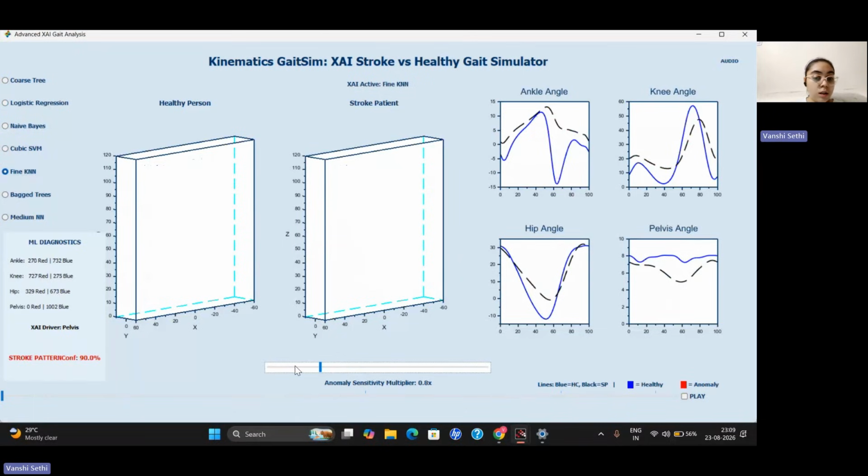And if you decrease this, you are decreasing the multiplier. It means sensitivity. Actually, I calculated the sensitivity. It came out to be 0.76, which I have provided in its code. But for now, it has 0.76, but now I'm decreasing it. So it may be able to show mild deviation like that. So you can see the movement, only mild deviation like that.